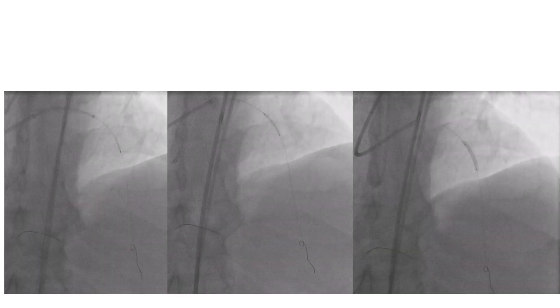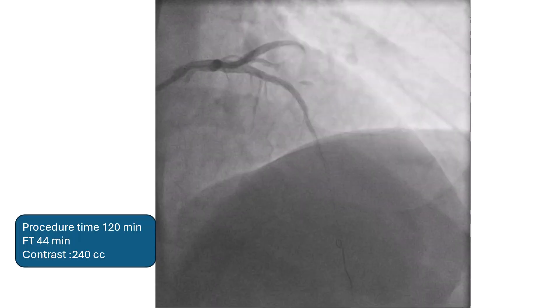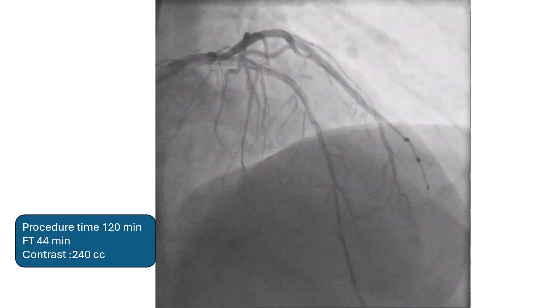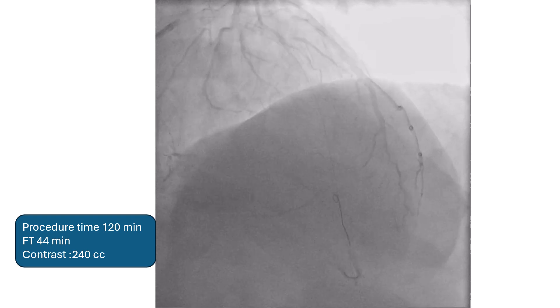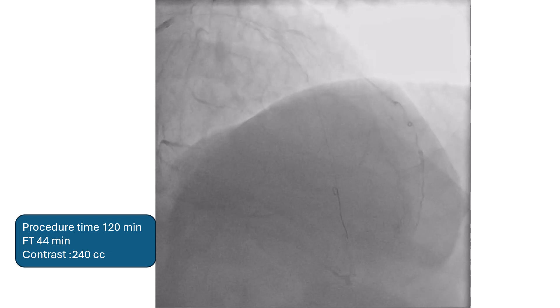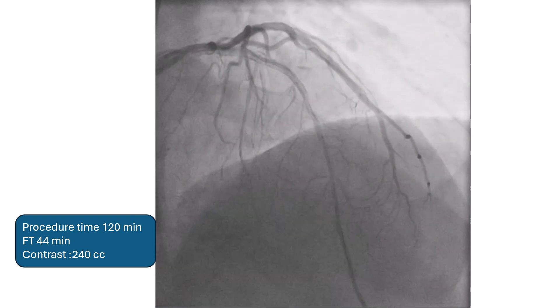Further ballooning was easier and was done sequentially. This was followed by stenting with a good final result, although some small diagonal was jeopardized.